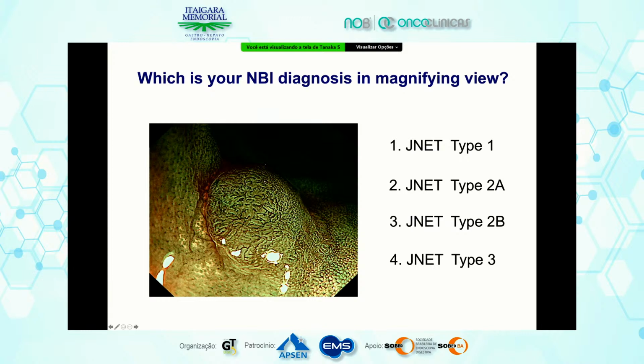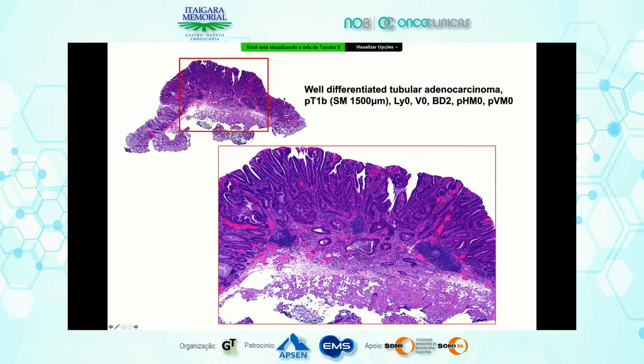Over-diagnosis is dangerous because over-surgery will be conducted. So anyway, this is a very tiny lesion. We conducted EMR. This is also SM invasive carcinoma. JNET type 2B, JNET type 3, please pay attention to treatment selection.